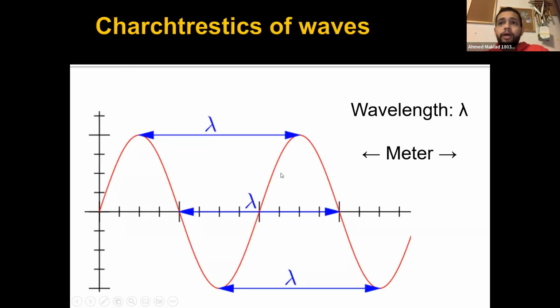Okay, so as the name implies, ultrasound uses sound waves, right, to create an image. And I'm going to show you how that happens, right? And I need you guys to remember that the wavelength of ultrasounds are way longer than X-rays and CT scans, because X-rays are on the other side of the spectrum of the waves, right? They are high in frequency and low in wavelength or magnitude. Right? And ultrasounds are on the other end of the spectrum, where they have low frequency and larger or bigger wavelengths. Okay.